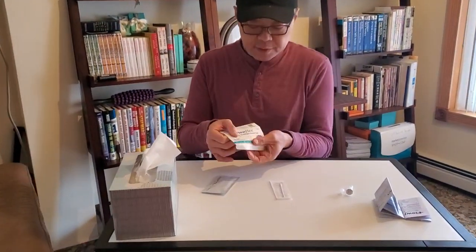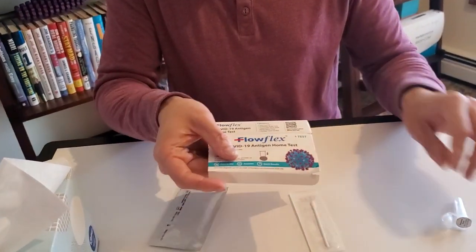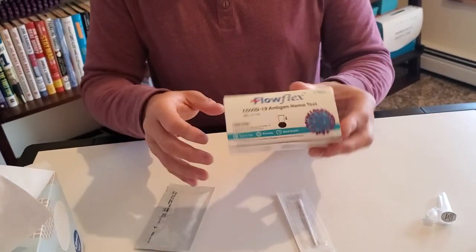You see a perforated hole here in the middle. You push out that tab and close the box back — and that's your holder.